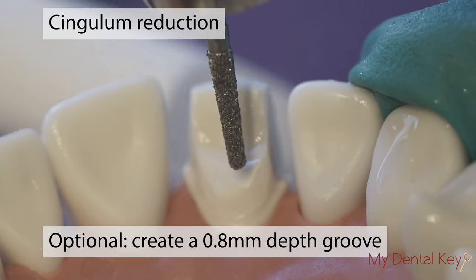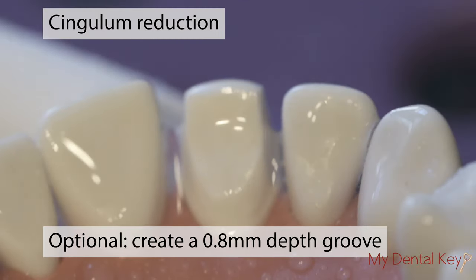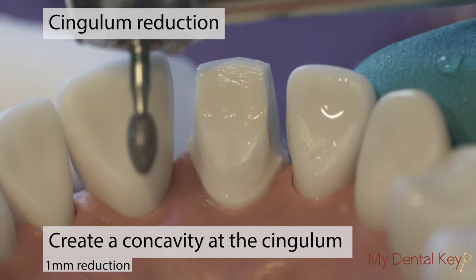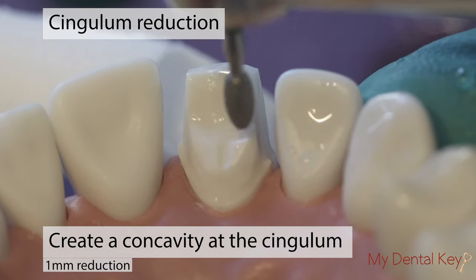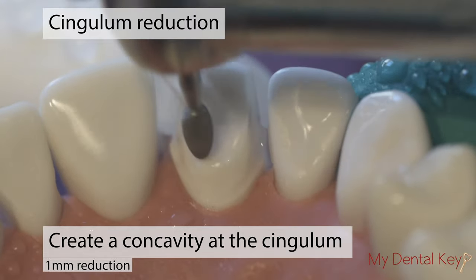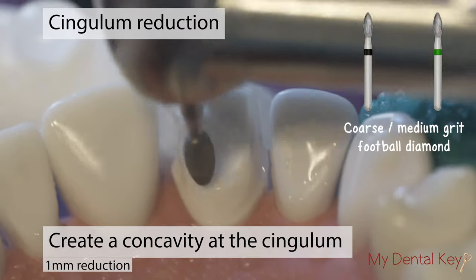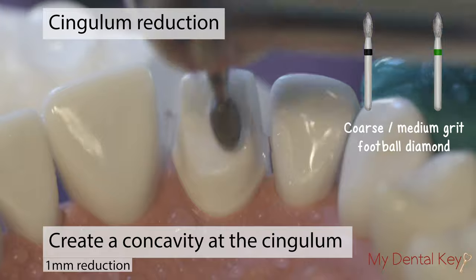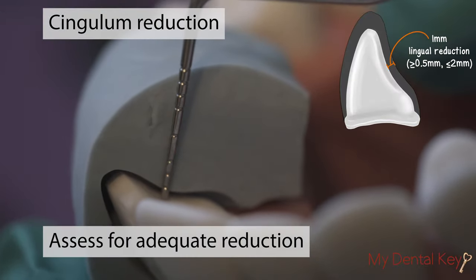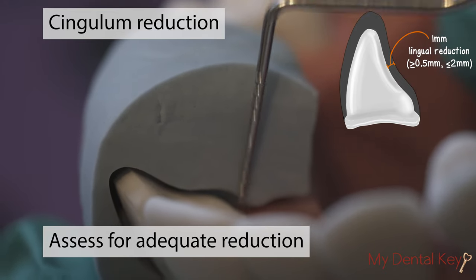For the cingulum reduction, it is again optional to create 0.8 millimeter depth grooves in the middle of the cingulum wall. Then, reduce the cingulum to create a concave form with a reduction of 1 millimeter. It is important to create a concave cingulum, but also retain an adequate lingual wall height. For this step, a coarse to medium grit football diamond is recommended. Compare this reduction against your facial lingual reduction guide and use your probe to measure as necessary.